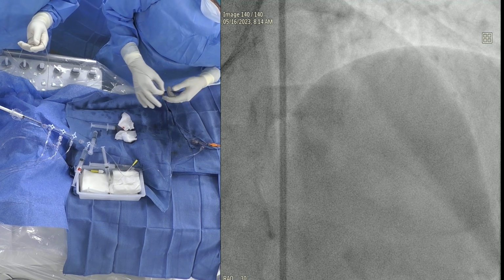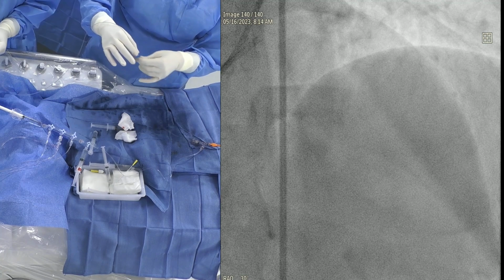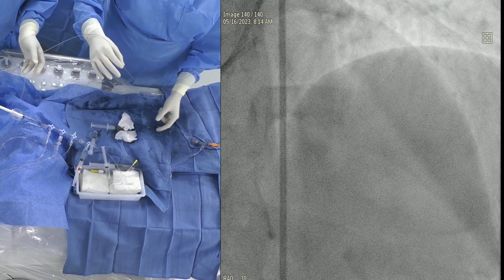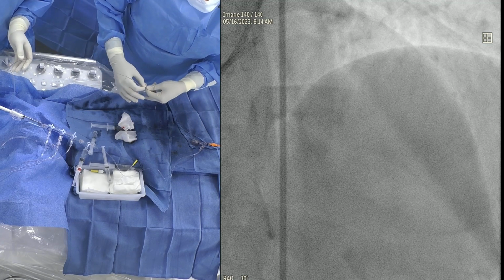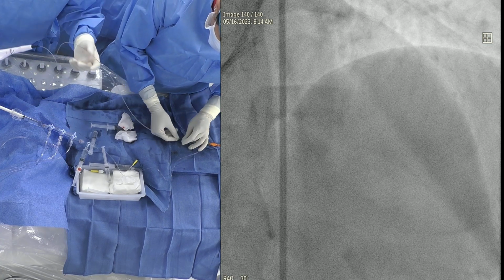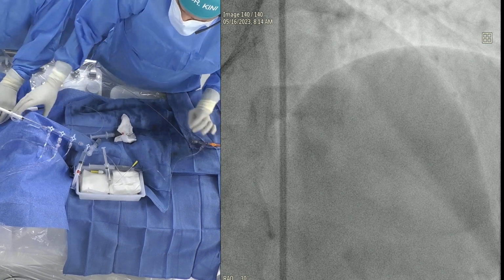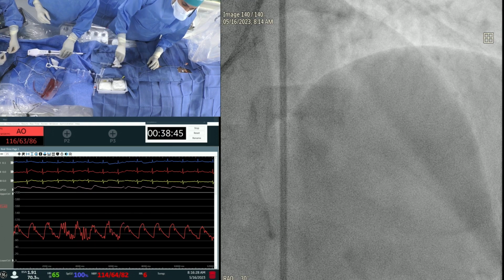Now, I would say that IVUS probably is very important in ostial LAD closure. Here you don't see really any nub or funnel shape of the ostial LAD, and you see an ambiguous cap, blunt tip. In that case, you put in IVUS, look where the ostial LAD is closed, and then you basically puncture with your stiffer wire there.